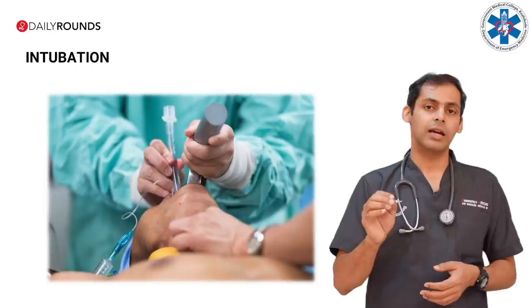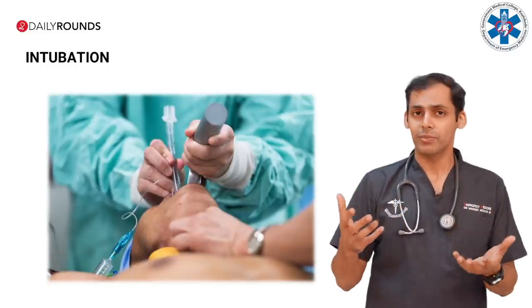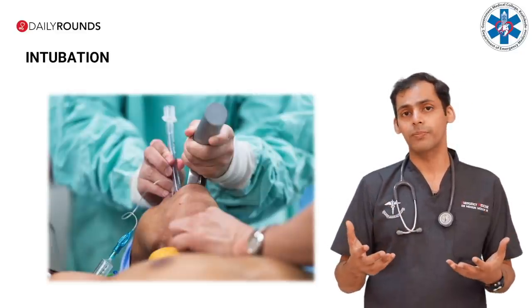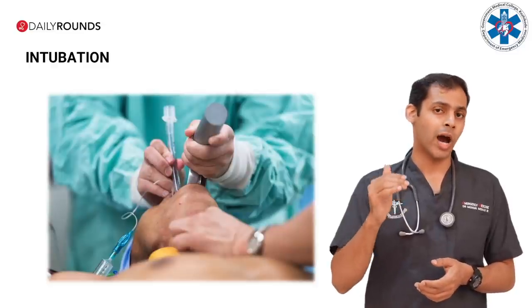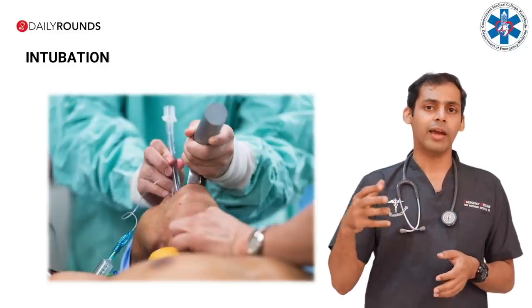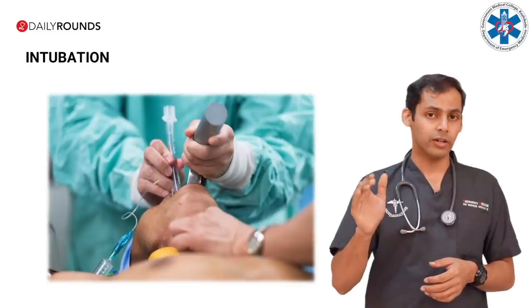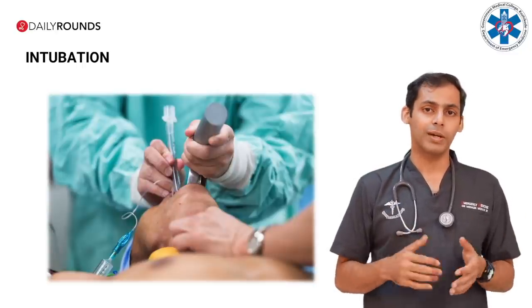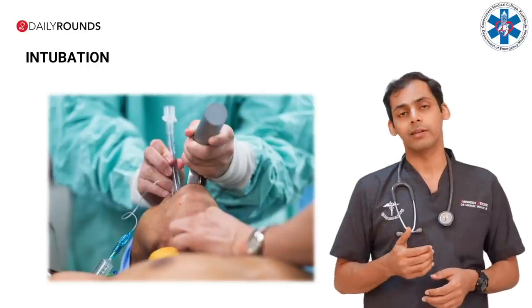Another thing you should realize is that these are not your pulmonary edema or COPD patients who respond well to your non-invasive ventilation and can be weaned off from them within a matter of hours or even a couple of days. Majority of these patients require ventilatory support of an average of 7 days, and delaying intubation in these patients may in fact cause more harm. So NIV may be used as a tool to buy us some time to get a ventilator or an ICU bed ready in those really sick patients with borderline hemodynamics. And it may be tried for longer duration only in selected population with mild to moderate symptoms and are relatively healthy without comorbidities and other organ involvement. Of course, you may use it if you reach a stage where no ventilators are available.